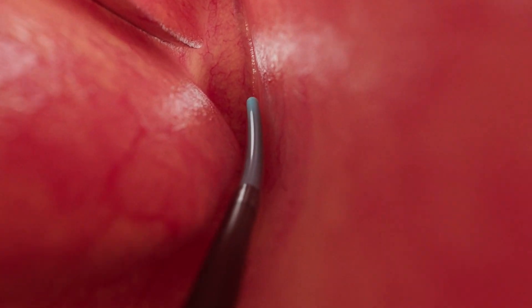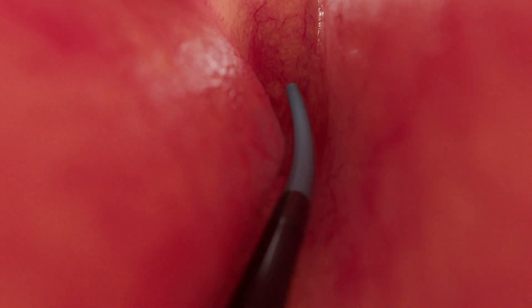Enter with the transnasal approach, with the device tip up or slightly rotated towards the patient's ear. Then track along the nasal floor to the opening of the Eustachian tube.